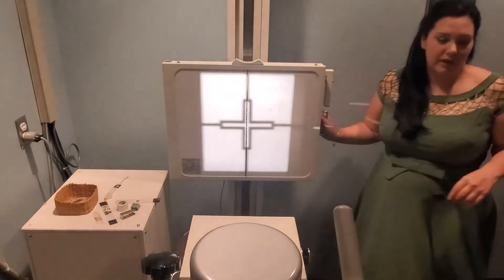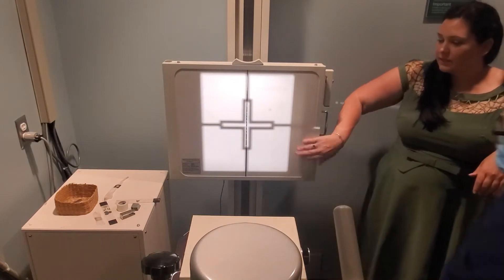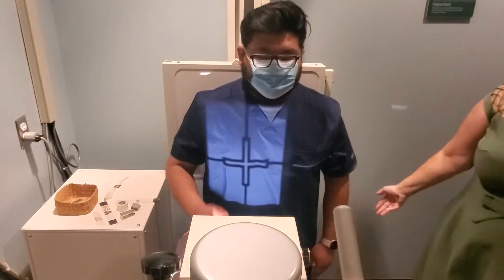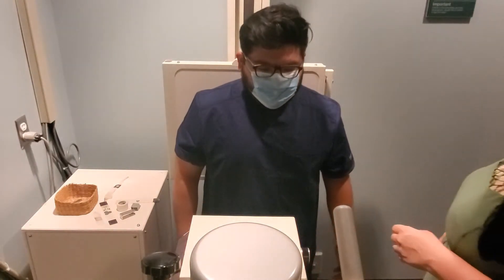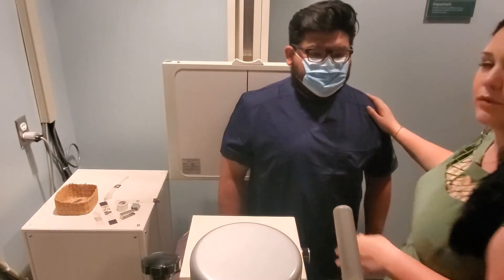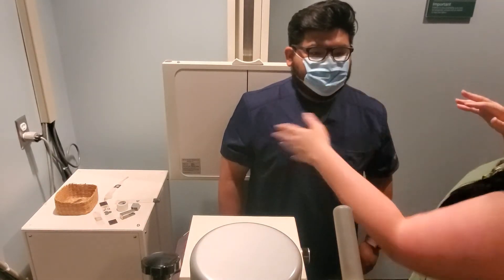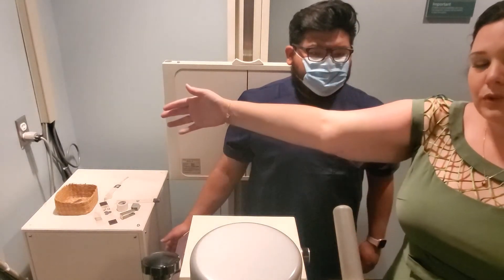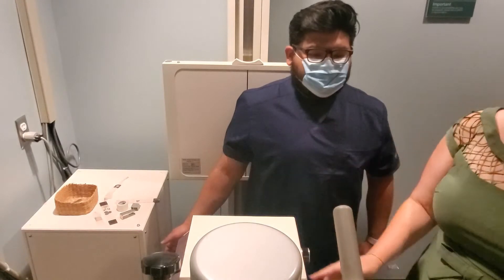For the AP humerus, have your patient stand in AP position and supinate the hand into anatomical position. Shift the body so the right humerus is in the center of the collimated field. Keep the hand supinated and don't abduct the arm too far from the body — leave it right at the side, otherwise it gets uncomfortable.